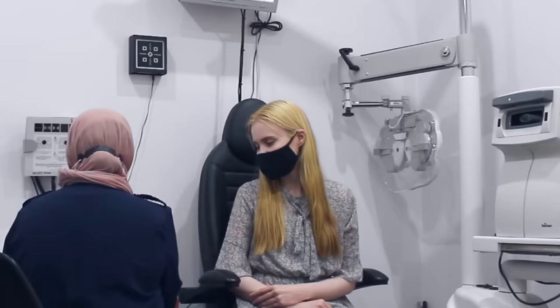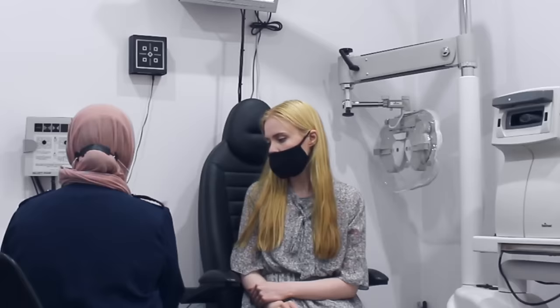So prescription-wise, let's talk about that. As I said, in your own glasses you're -1.25, and that means you're short-sighted. So in theory, yes, you use them only for distance. Your new prescription, I'm actually getting you slightly better at -1. Okay, but the left eye, as I mentioned, the astigmatism bit is about a quarter, all right? So your prescription has changed.